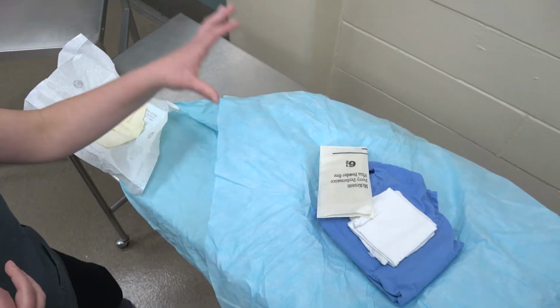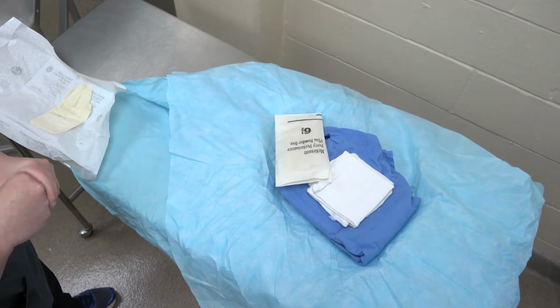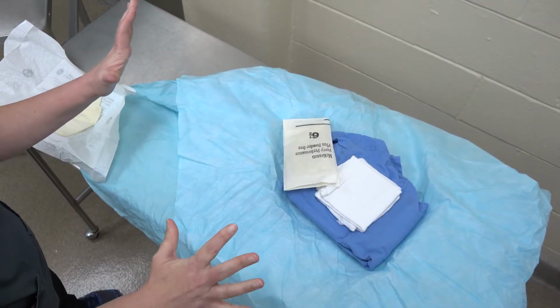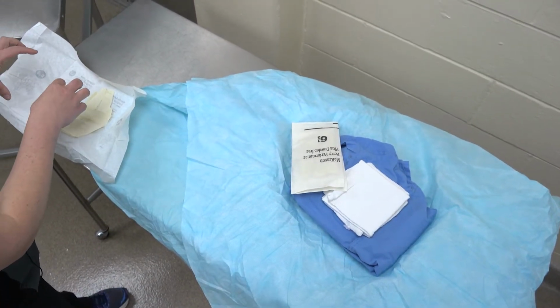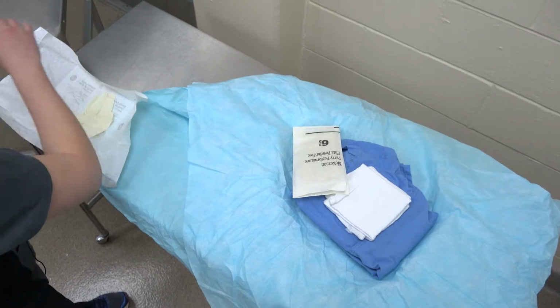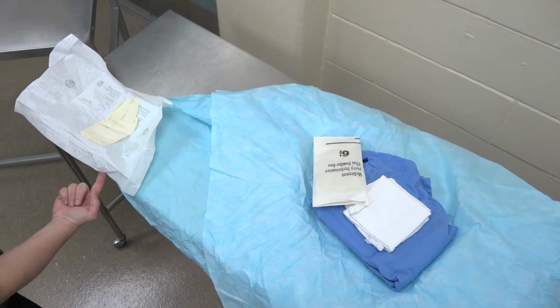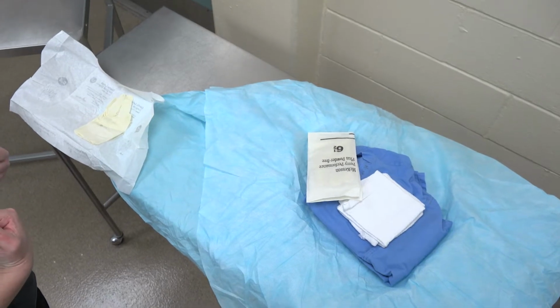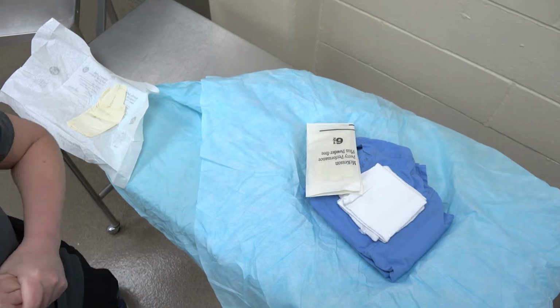I personally like to put my gloves onto the sterile field and then just manipulate it with my hands inside the sleeves. I feel like everything stays cleaner because this is a much larger area, whereas over here I have to be much more careful because this is not sterile, and then everything that I touch or is underneath this package is no longer sterile either. All right, now that we've got our gloves and gown ready, it's ready to scrub.